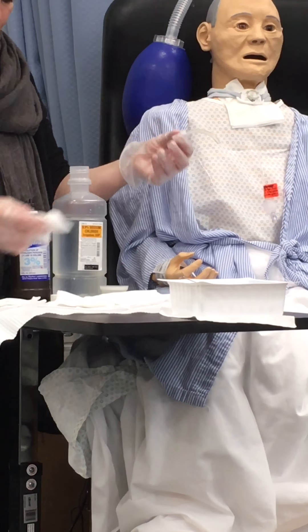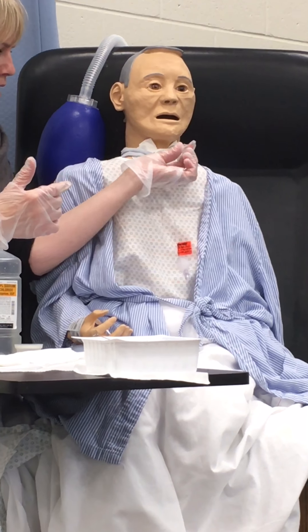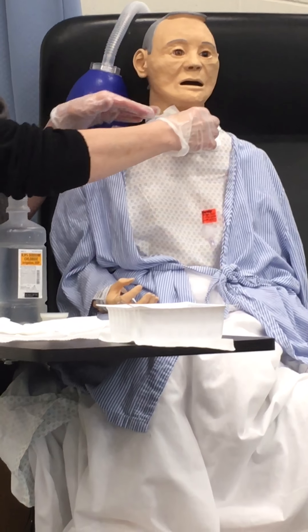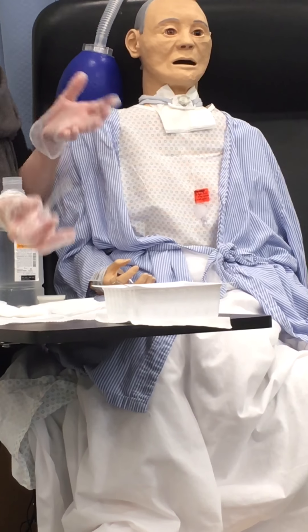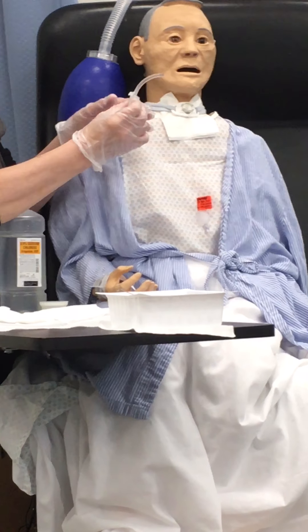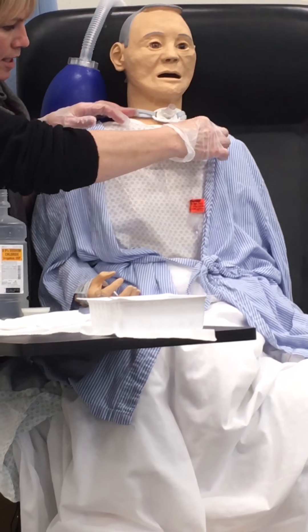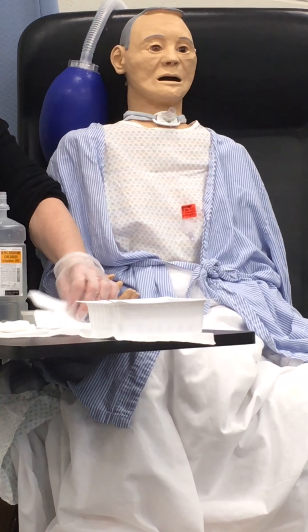So Jane, we're ready — that didn't really take too long. I would be facing her so I could see, but for your benefit, just going in like this. Once it's sort of in, my right hand is better. I'm done being sterile, so now I'm going to go in. Clamp down. If I went to do my right hand first, it comes out so much easier, but I wouldn't be able to hold that. Two different ways — you could actually let it sit in there, clean it, but you'd have to keep that sterile hand. Last thing we're going to do is change that dressing — just kind of slide it out as a corner.